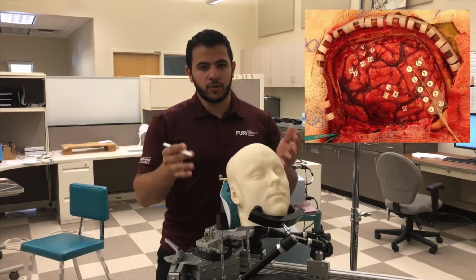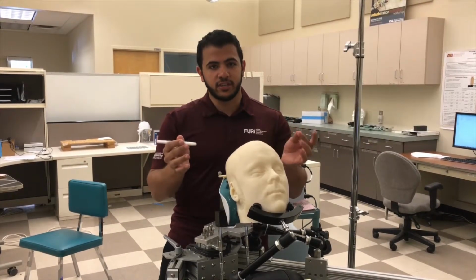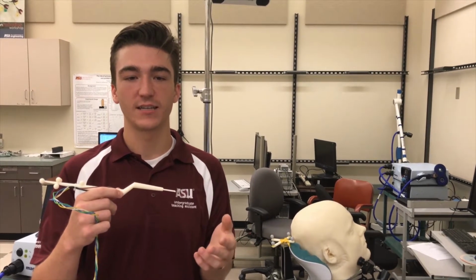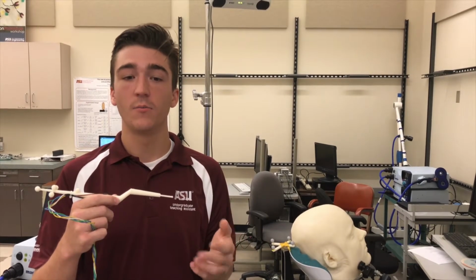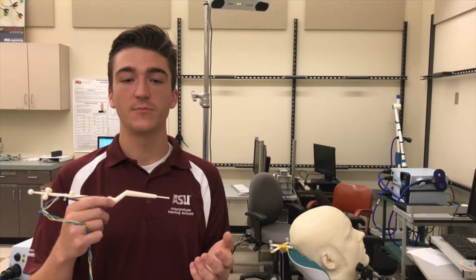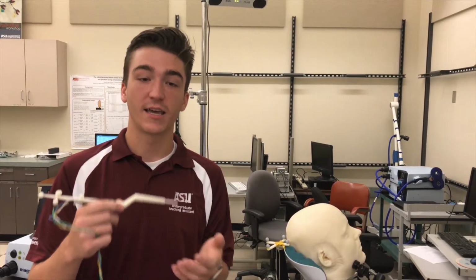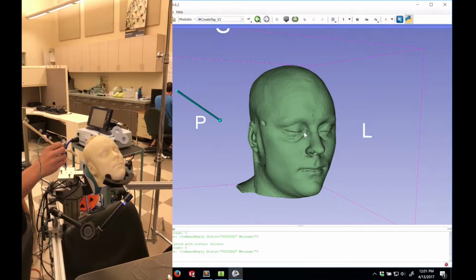This is a big problem in neurosurgical procedures. These papers are often misplaced and often washed away during irrigation. The goal of the NeuroMap device is to combine cortical stimulation with stereotactic navigation techniques to digitize the tagging process. This method will allow greater accuracy, more efficient tagging placement, and greater flexibility in the shape and distribution of these tags. Tags will be applied using a custom tool which contains both stimulatory electrodes and tracking hardware.